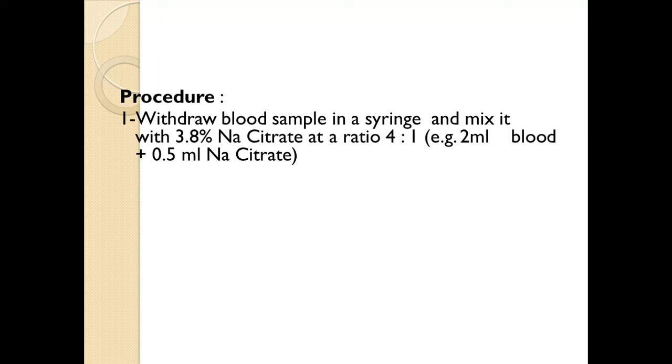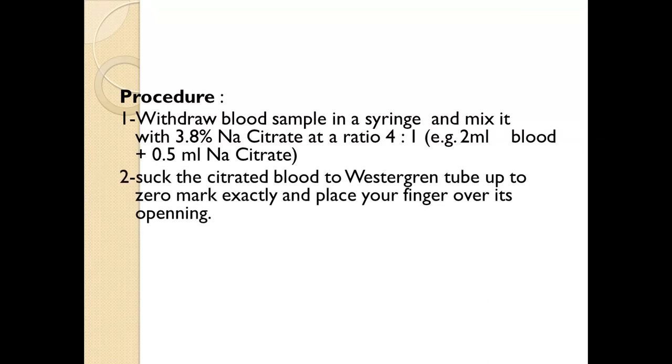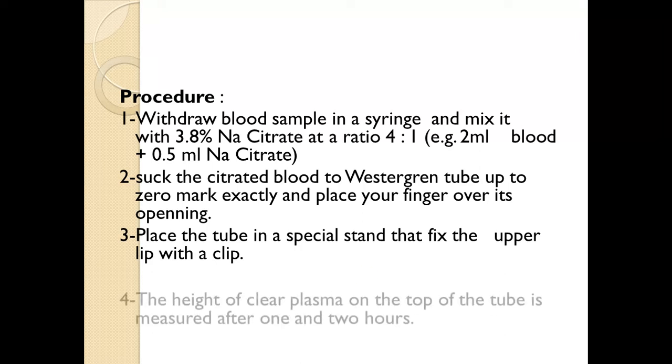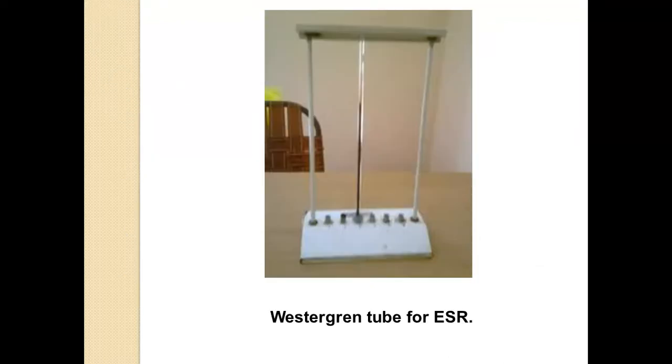That is, 2 ml of blood plus 0.5 ml of sodium citrate is taken. Then suck the citrated blood into the Westergren tube up to the 0 mark exactly and place your finger over its opening. Place the tube in the special stand and fix the upper lip with a clip. The height of clear plasma on top of the tube is measured after 1 and 2 hours. This is the stand and the central one is the Westergren tube filled with blood.